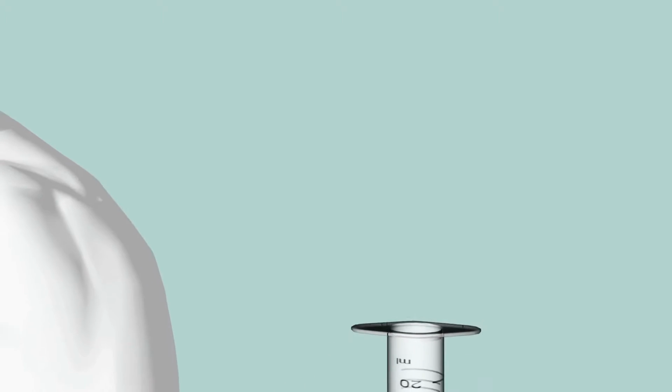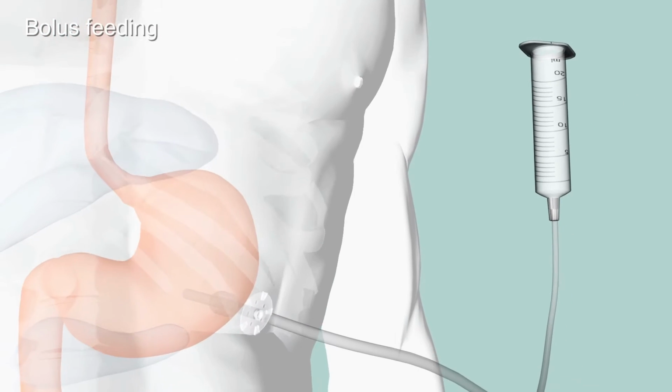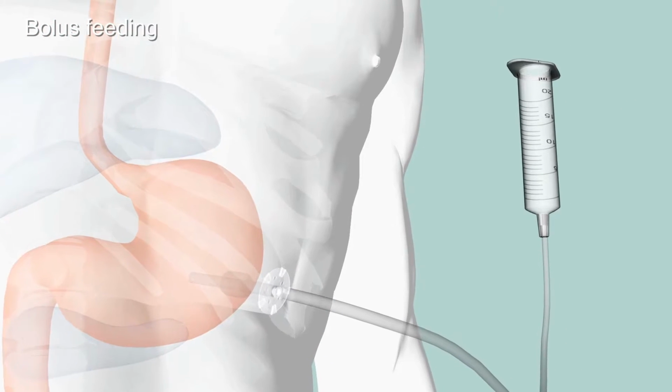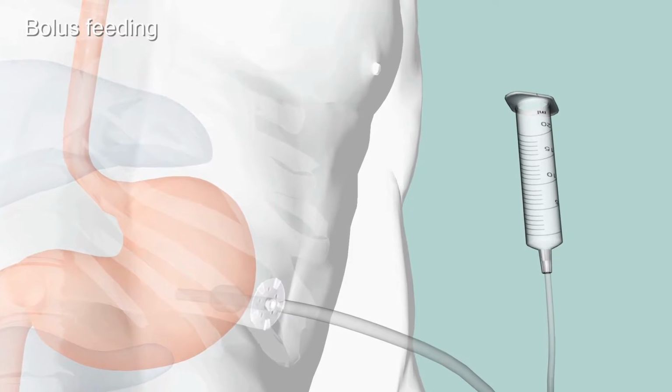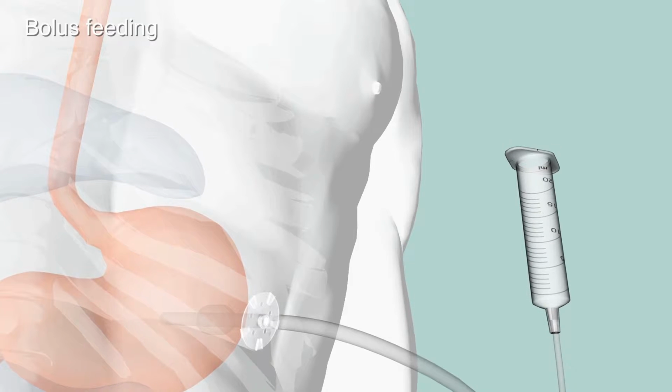The two most common feeding methods are bolus feeding and pump feeding. A bolus feed uses a syringe to give a prescribed amount of formula over approximately 10 to 15 minutes, usually 4 to 6 times each day. A water flush is often given before and after each bolus feed.